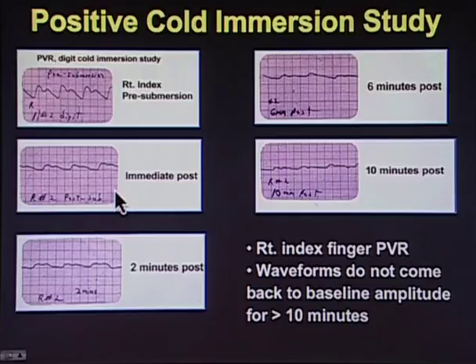Following the cold submersion, we did another PVR waveform, and the amplitude is quite reduced, as we expect. This is at 2 minutes. This is at 6 minutes. And we stretched this out to even 10 minutes. This patient had still not shown any sort of improvement in the perfusion 10 minutes following this cold submersion. They were in quite a bit of pain as well, so we ended up using a heating blanket to try and release the spasm.